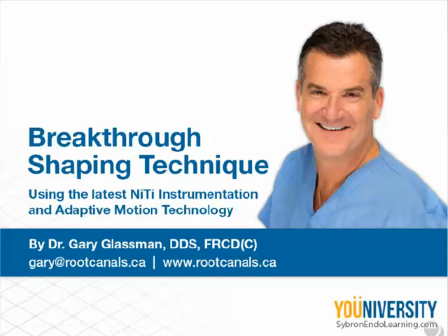Let me see here. Do I use ultrasonic tips at the end of my root canal preparation? You know, I don't. But you can. There's nothing that says that you can't. And certainly ultrasonic has its benefits with the final irrigation protocol.